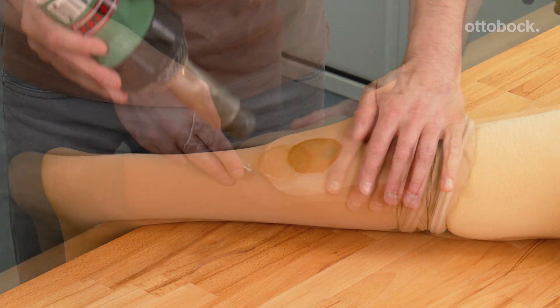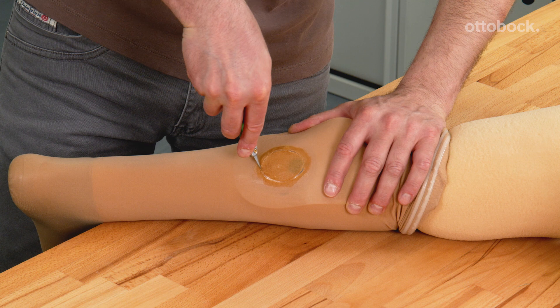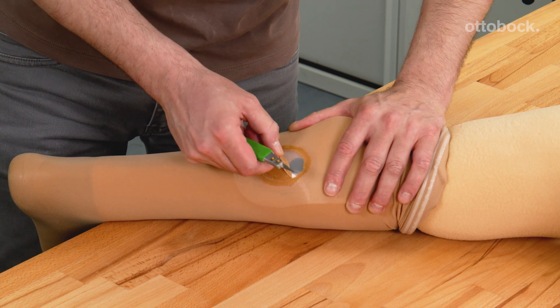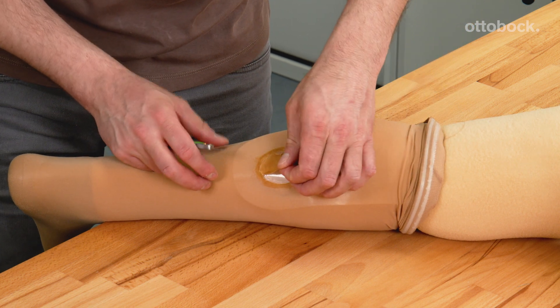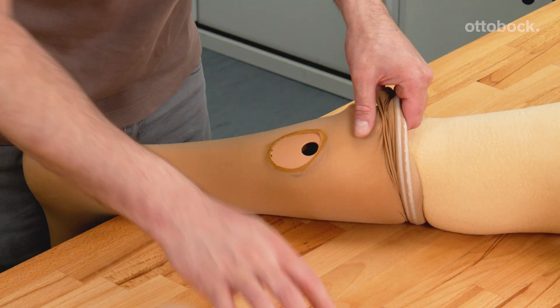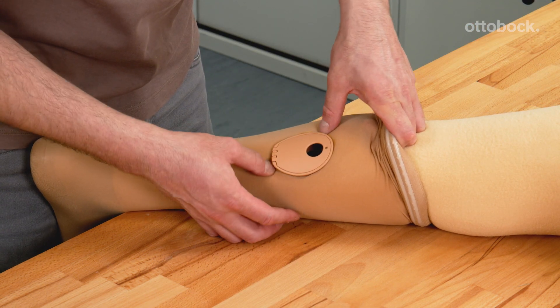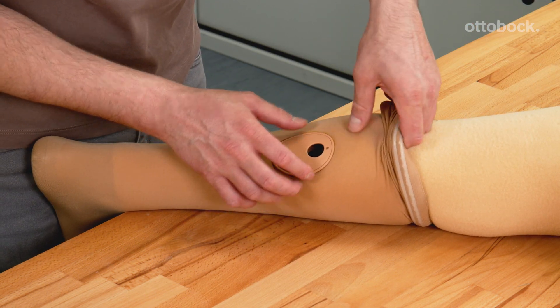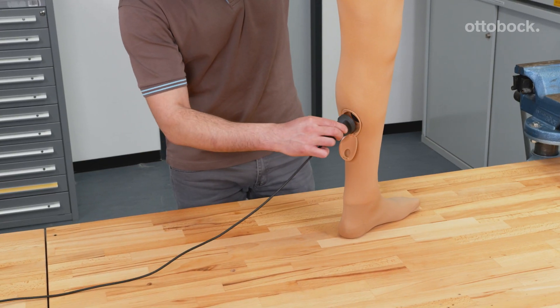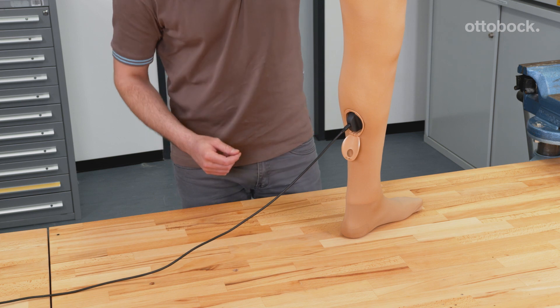Once the glue is dry, a hole can be cut in the stockings. To ensure a tight fit, a smaller hole than the charging shaft cover is recommended. The stockings can be carefully stretched around the charging shaft, hiding the glued area. Finally, check the assembly by connecting the battery charger.